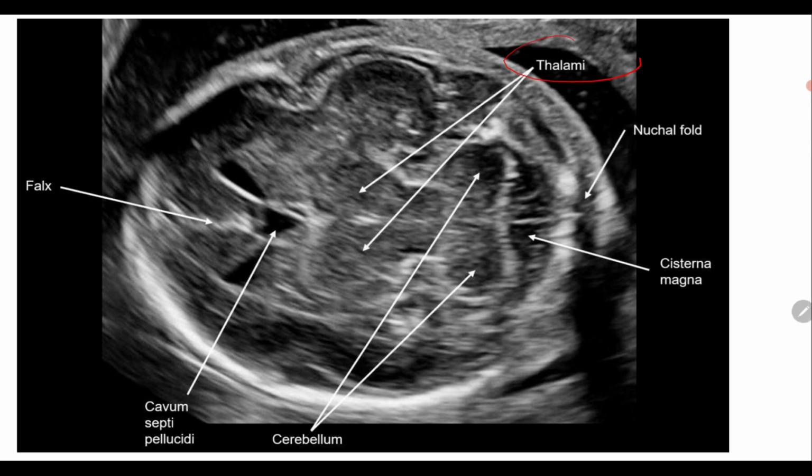Both sides of the thalami have been visualized. You can see this is the thalami, this is the thalami, and this is your falx cerebri. This is the falx, this is the cavum septum pellucidum. Okay. Then you can see this is the cerebellum, this side, this is the vermis. Okay. This is behind the cerebellum. You can see these cystic spaces. That is your cisterna magna, and this is your nuchal fold thickness.